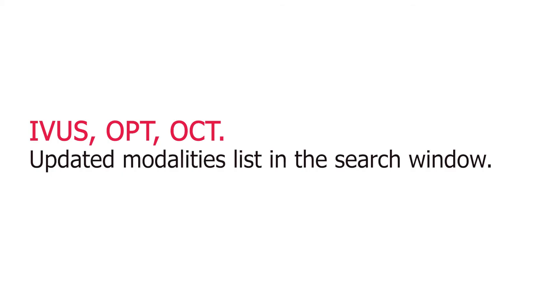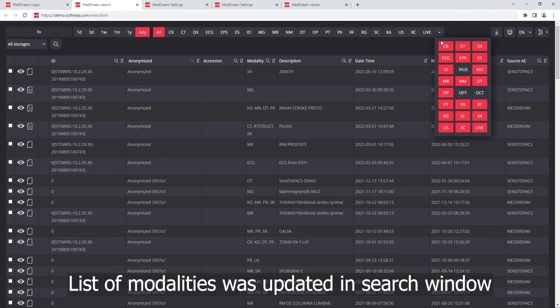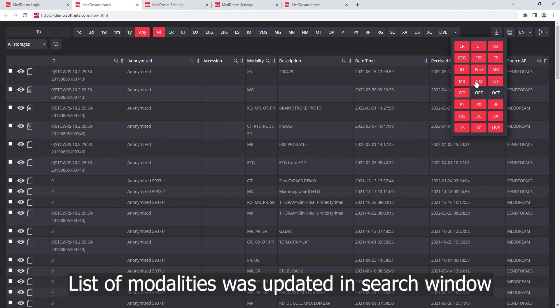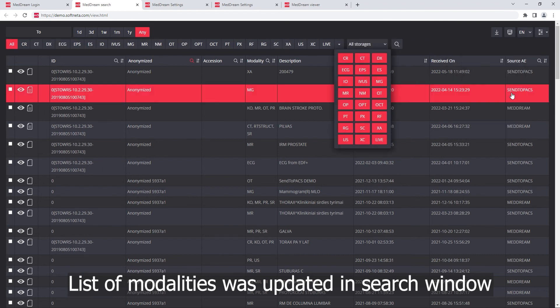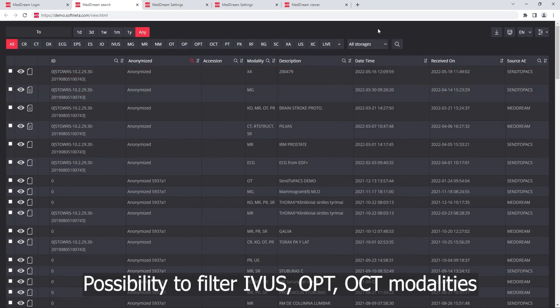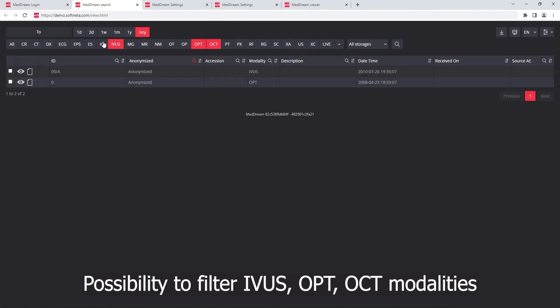Updated modalities list in the search window. The list of modalities was updated, with the possibility to filter IVUS, OPT, and OCT modalities.